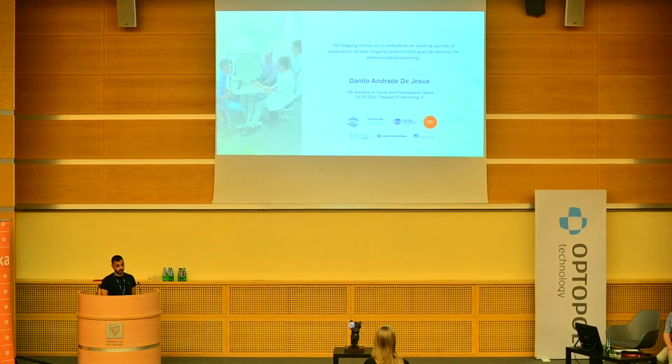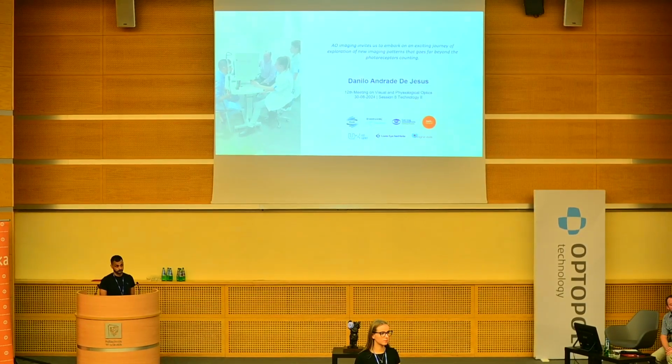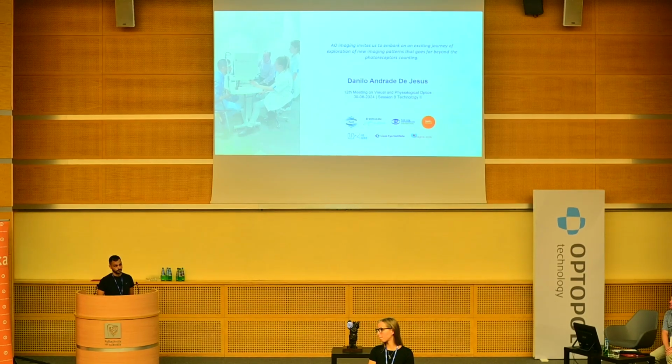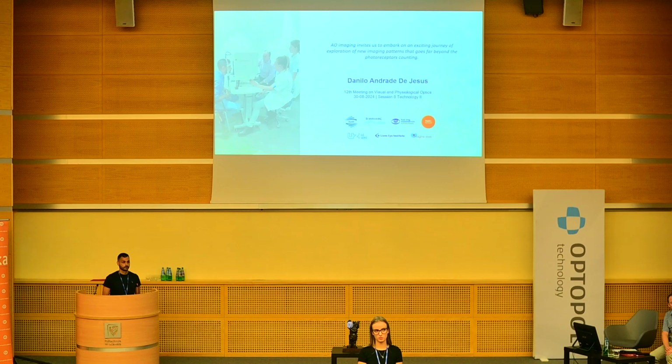The question, but I see a problem with RTX1. I was very eager when it was introduced to the market, but the problem is that you can get good images of high quality when you have young subjects, young patients. When people start cataract, early cataract, almost invisible, for example in an optometric examination, then this machine gives very difficult to analyze images. So if you think about clinical application, there is a natural problem.